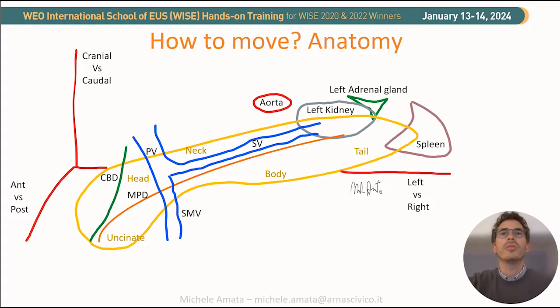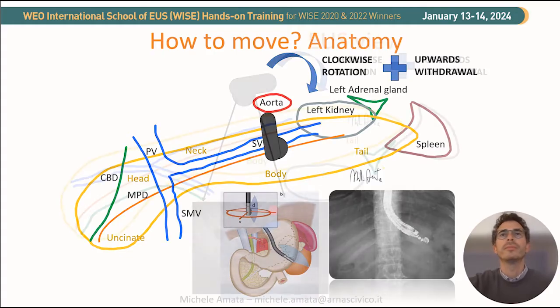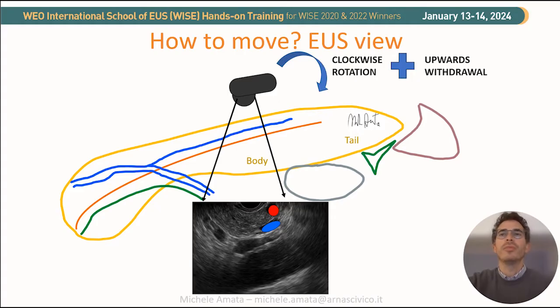We need to continue looking posteriorly, and after reaching the pancreatic parenchyma of the neck and body, we need to do a clockwise rotation and upward movement with a small progressive withdrawal of the scope to fully interrogate the body and tail. Near the transducer we will have the pancreatic body, and the splenic vessels are the landmarks to follow. The splenic artery is usually imaged on the proximal side of the transducer with a round shape and not compressed, and the splenic vein is imaged at the distal side and is possible to compress. Color Doppler and power Doppler can help identify the splenic artery and vein.